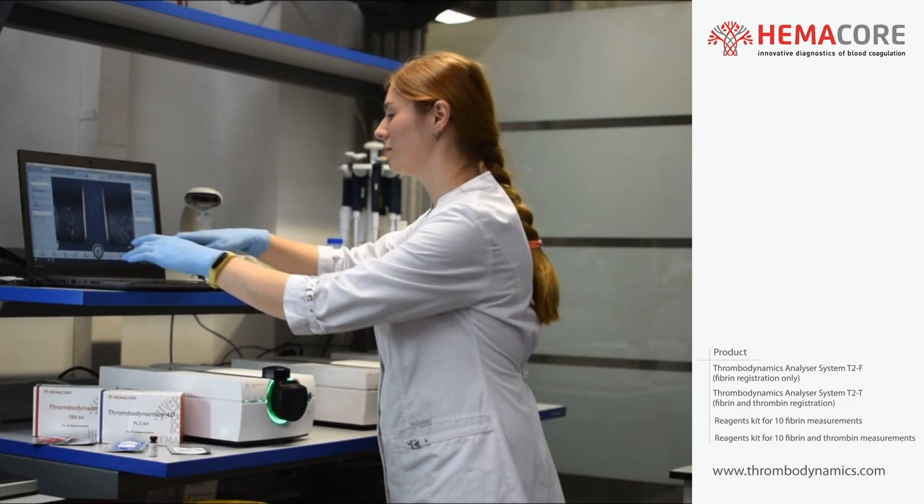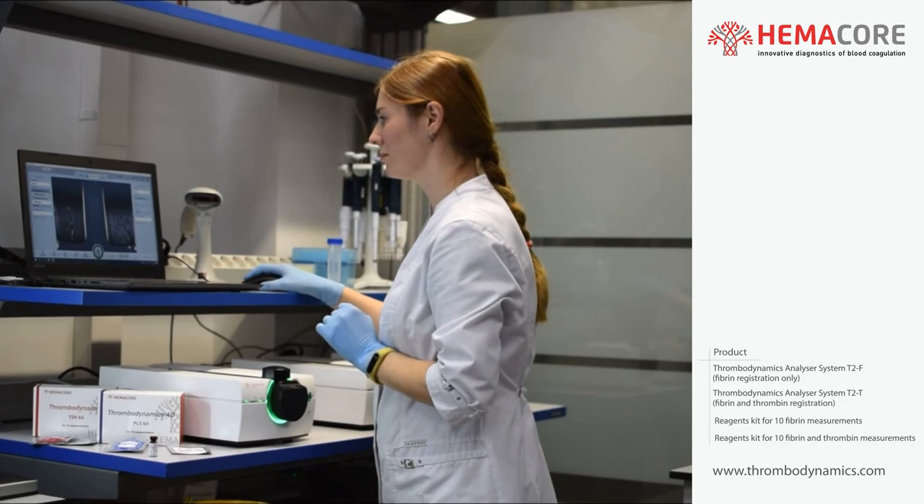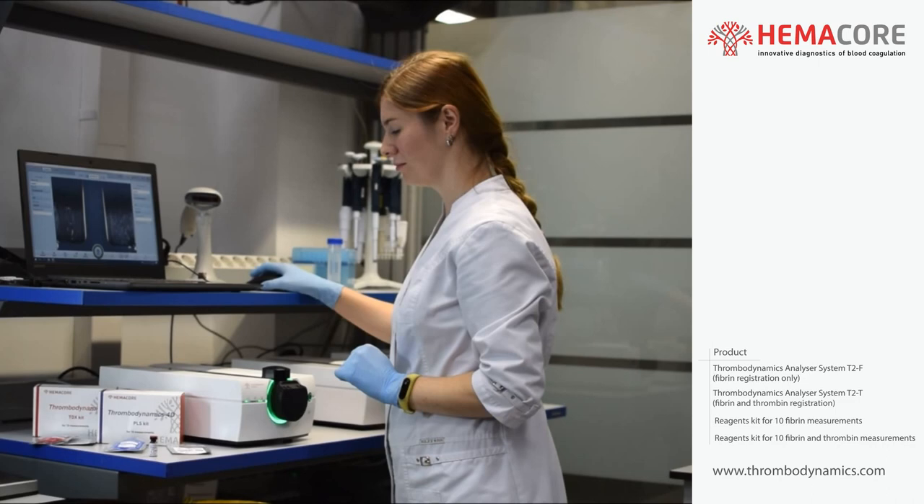Enter sample data for each channel. Sample code, measurement title, and plasma type fields are necessary for filling. Select kit and test type — Thrombodynamics or Thrombodynamics 4D — for each channel.